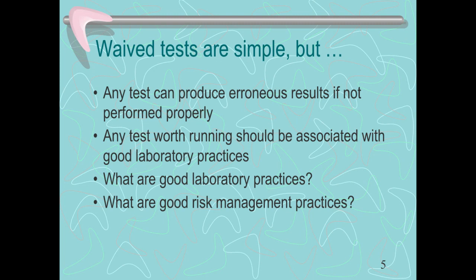It has to be put into a solution and swirled around and then let sit for a minute. And then you take the swab out, put a specific testing strip in there, set a timer, and then the testing strip will determine whether it's positive or negative. But say I didn't get back far enough to get mucus on that swab.